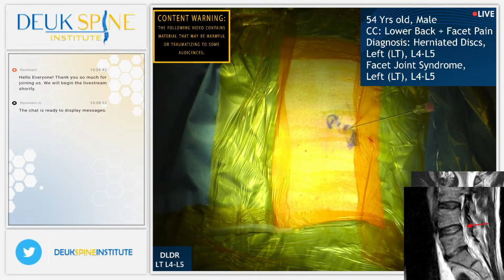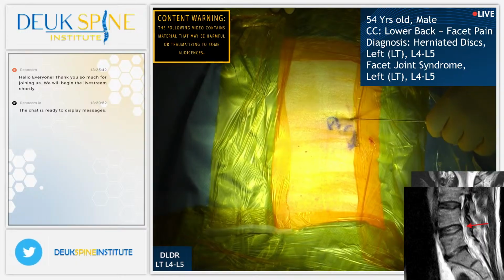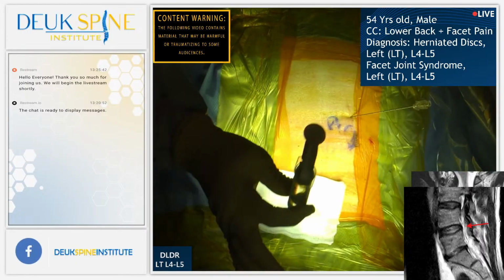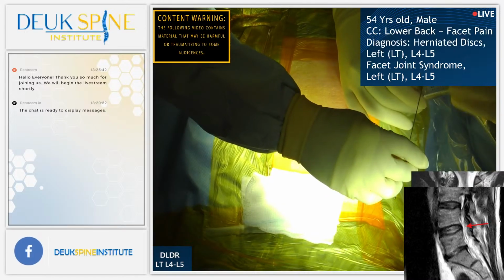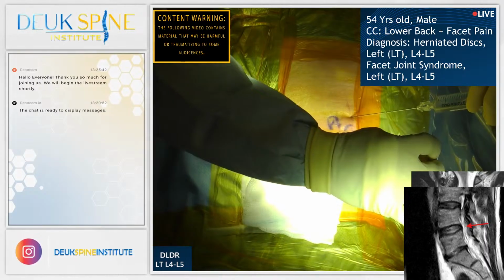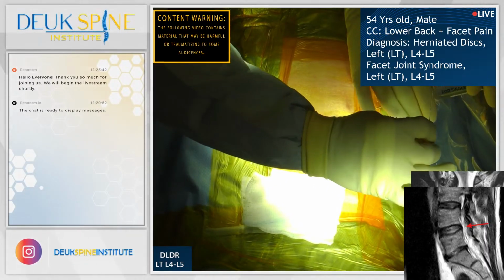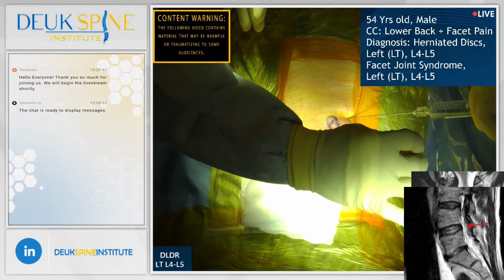So instead, he has a herniation at L4-5, and we're going to go take care of that. It's a very mild, very small bulge, but it is visible on the T2 sagittal images. And by the way, L4-5 is the most common disc to cause back pain.